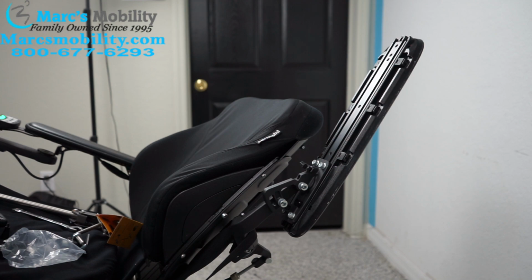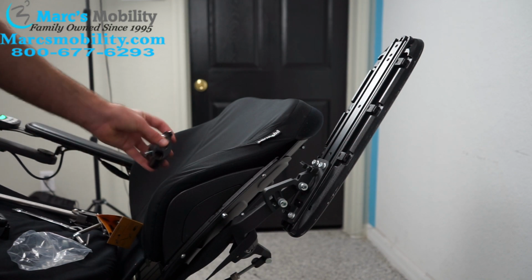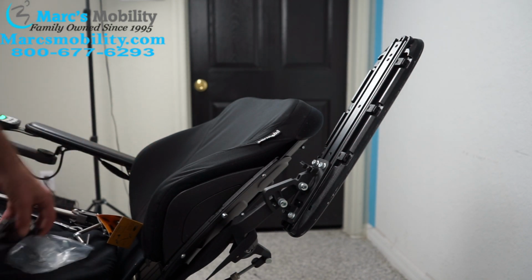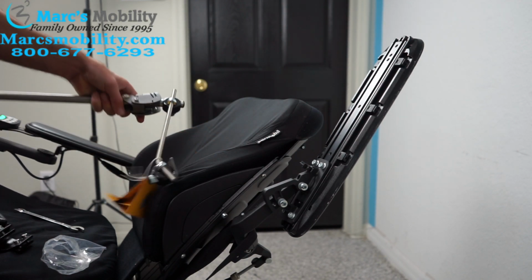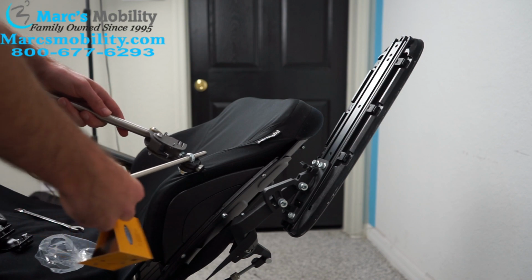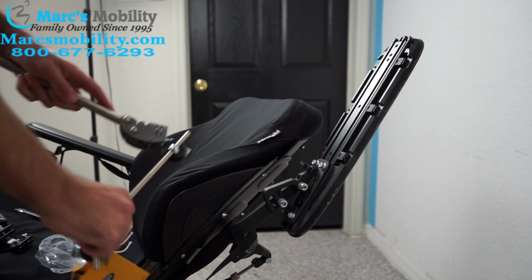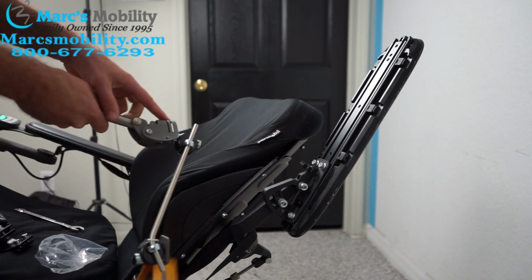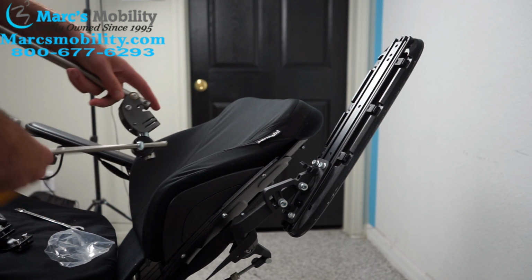Today I'm going to show you how to mount a tablet holder on a Permobil power chair. So what I have here is your mounting bracket, so you should have one of these. We've got our Omni Control Arm here, and the way this works is to get it to lock into place, you will push this up, it'll snap right here. If you want to move it out of place again, you will push this metal piece forward, and now you can adjust it.